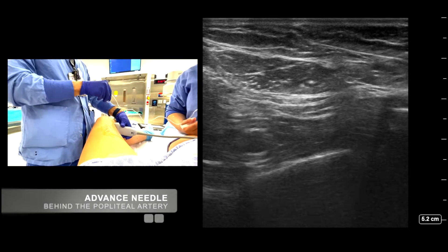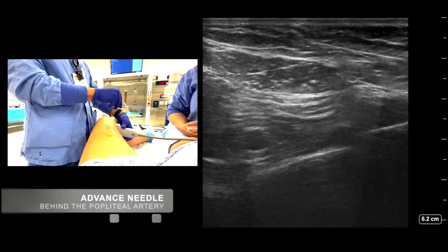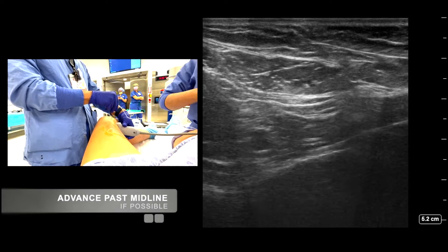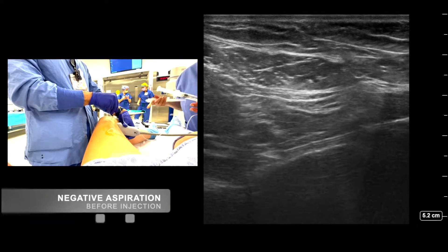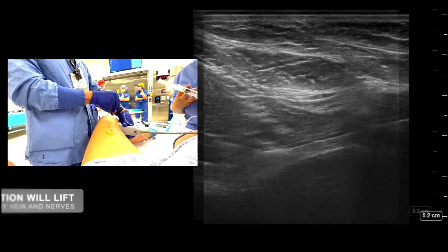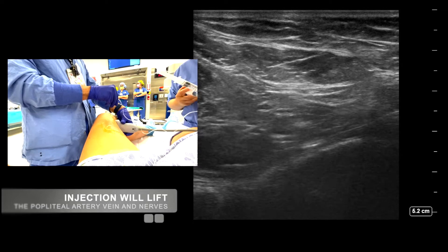Advance the needle behind the popliteal artery. Advance past midline if possible. Perform negative aspiration before injection. The injectate will lift the popliteal artery, vein, and nerves.